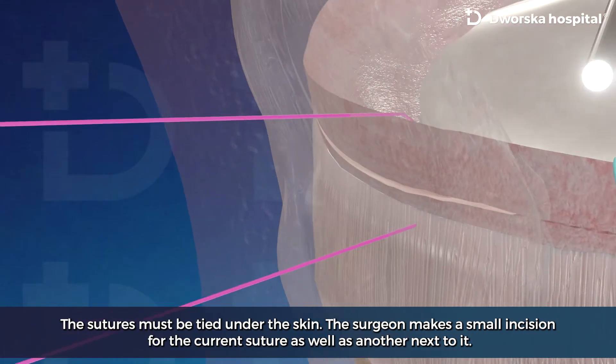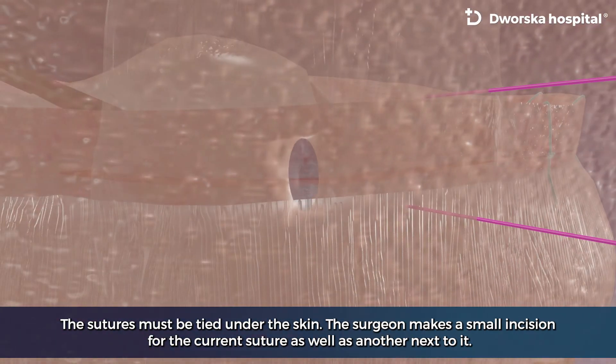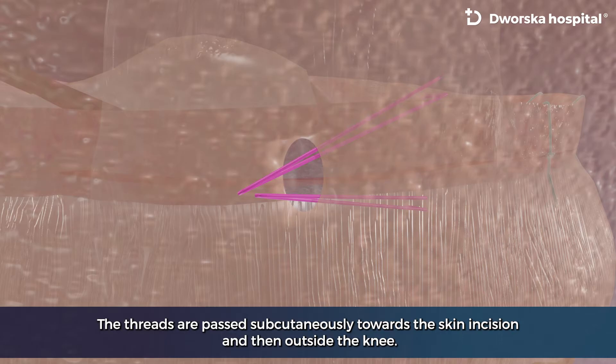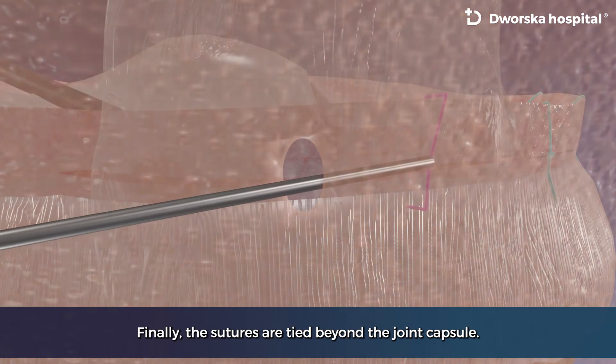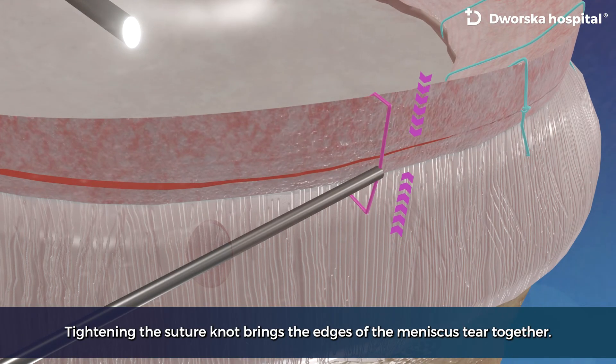The sutures must be tied under the skin. The surgeon makes a small incision for the current suture as well as another next to it. The threads are passed subcutaneously towards the skin incision and then outside the knee. Finally, the sutures are tied beyond the joint capsule. Tightening the suture knot brings the edges of the meniscus tear together.